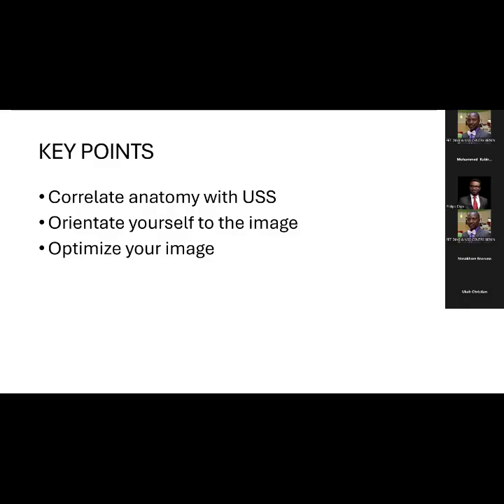Thank you very much. I would like to know. I recently did a transvaginal ultrasound for a postmenopausal patient, and I was measuring the endometrial thickness. I saw the hyperechoic area delineating the endometrial thickness, but of course the triple line was not there because she's postmenopausal.